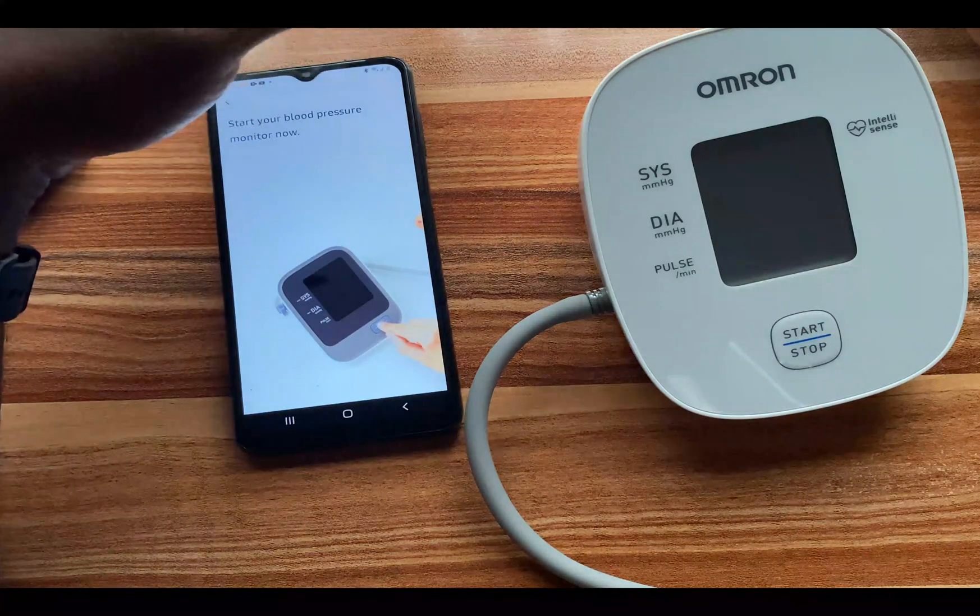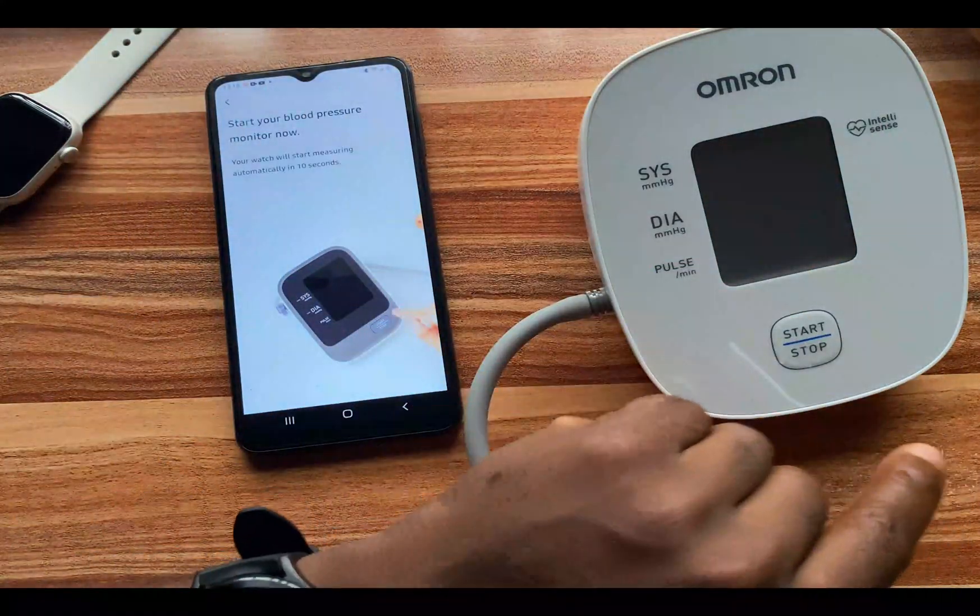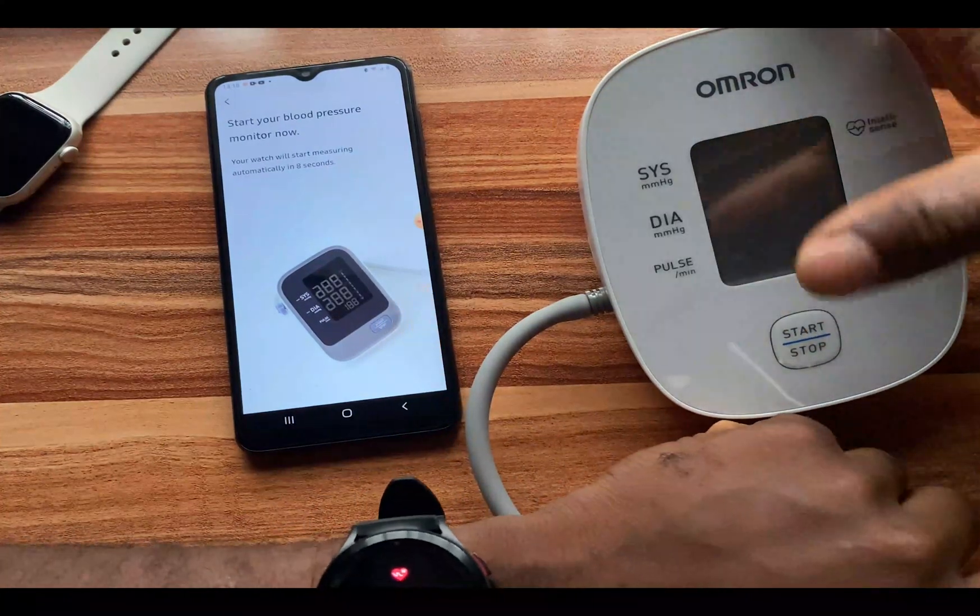It says 'Start your blood pressure monitor now,' so I'm going to tap on that and I have to stay still to get the best possible measurements.